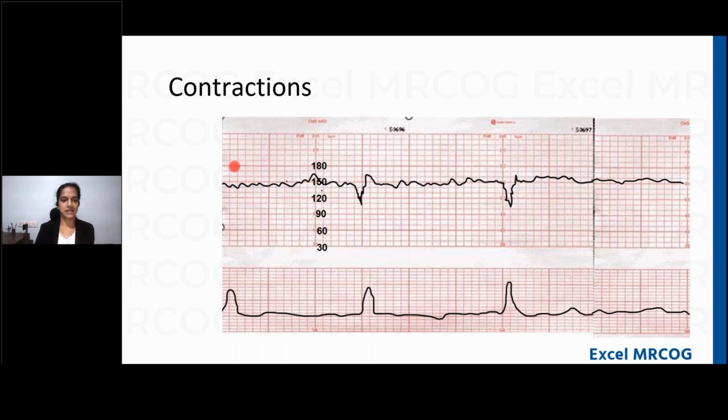So this is 3 centimeters, from this first line to this line. So this is 1 minute, second minute, third, fourth, fifth, sixth, seventh, eighth, ninth, 10th. So this CTG tracing is over 10 minutes, which is not sufficient for you to interpret the CTG. You would obviously need at least a 30 minute tracing for a good CTG interpretation.